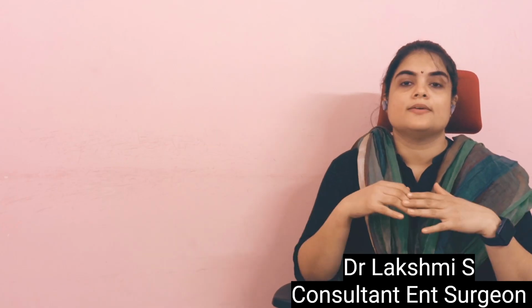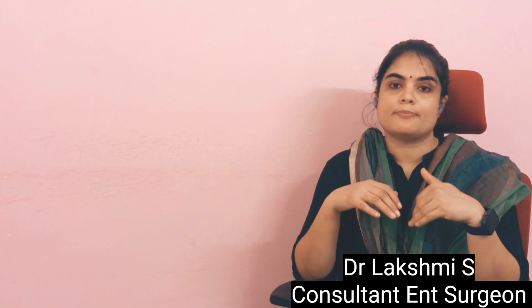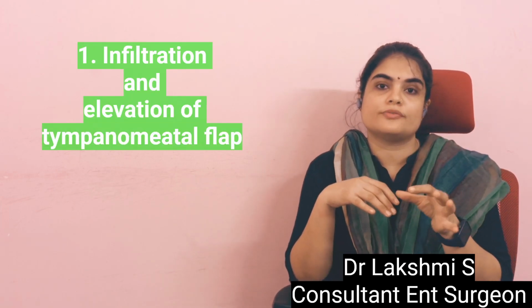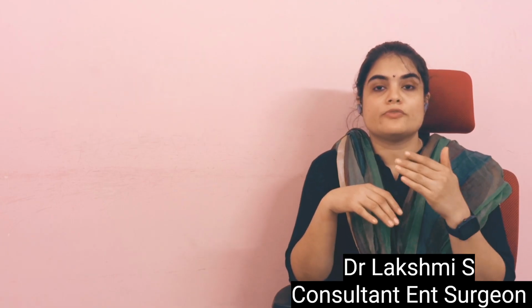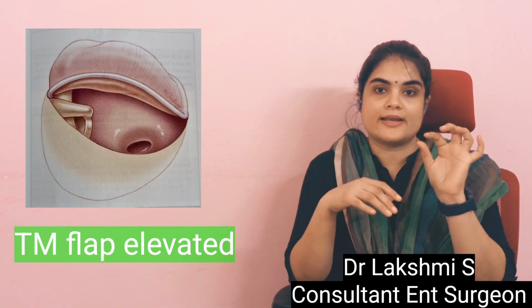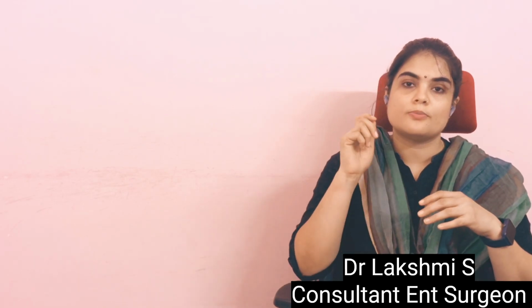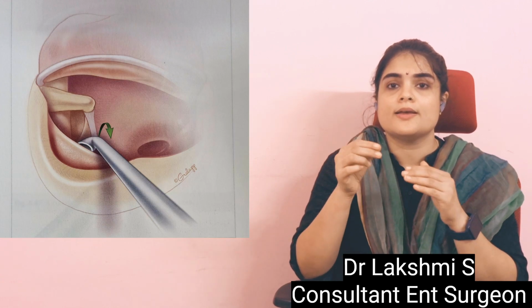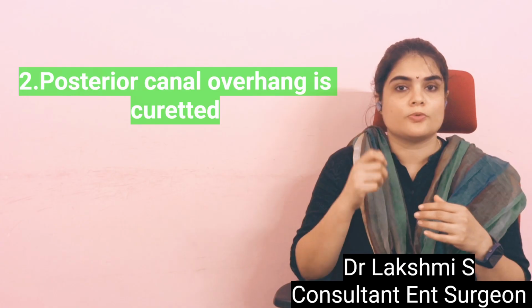Draping, everything is done. Then you give the infiltration. The 4-quadrant infiltration is given and the tympanomeatal flap is elevated. For proper exposure of the oval window niche, you need to visualize the tympanic segment of the facial nerve and also the pyramidal eminence where the stapedial tendon is attached. For this, the posterior canal overhang must be removed. So you can curette the bony annulus posterosuperiorly. You can either use a drill or a curette, or both. You can use the drill to slightly thin it, and then curette with the curette.